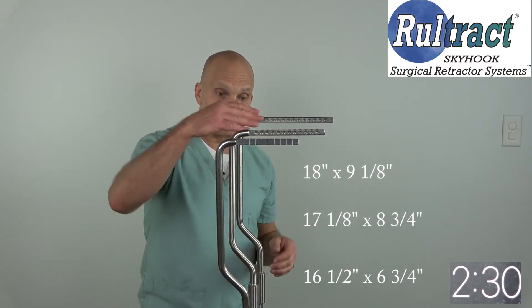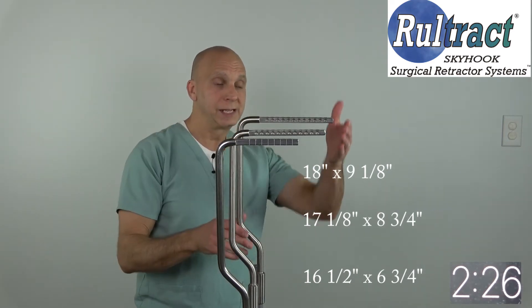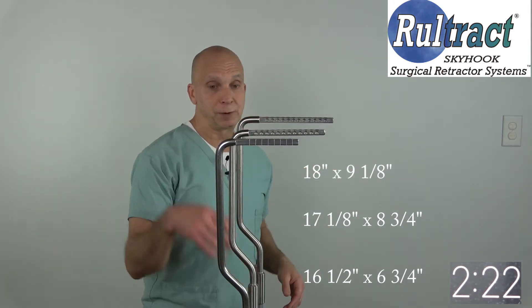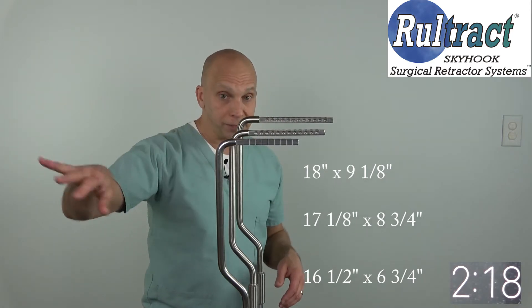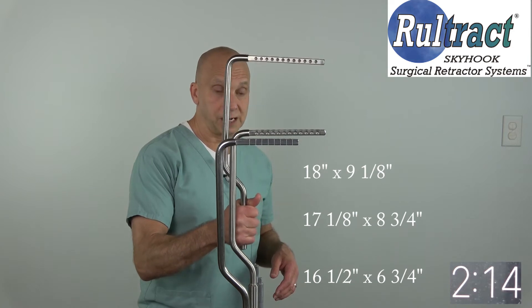Option three is our current generation top post. You can see that it obviously provides additional height over the two older ones and also reaches further out over the table. My recommendation would be if you have these two older ones, get rid of them and replace them with the standard length top post — the newest.